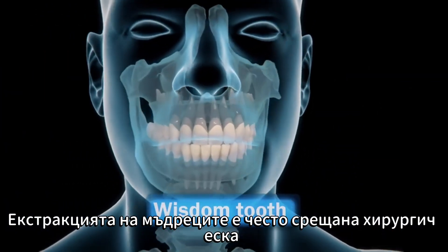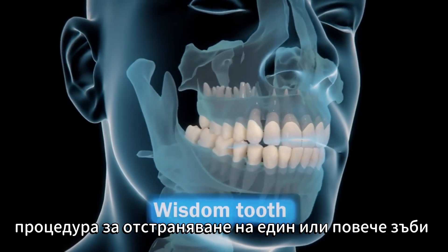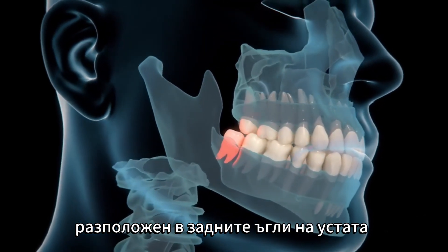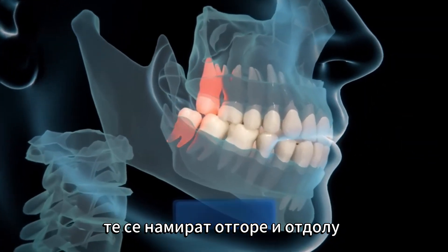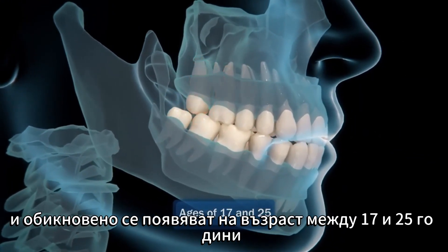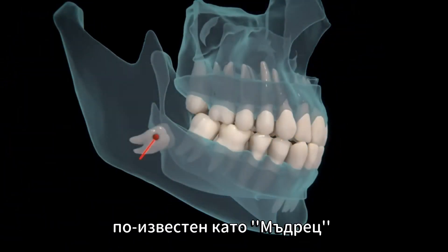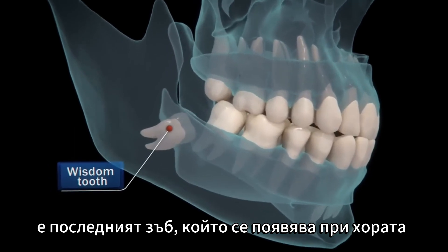Wisdom tooth extraction is a common surgical procedure to remove one or more wisdom teeth located at the back corners of the mouth. These are found on the top and bottom and usually appear between the ages of 17 and 25. The third molar, better known as wisdom tooth, is the last tooth to appear in humans.